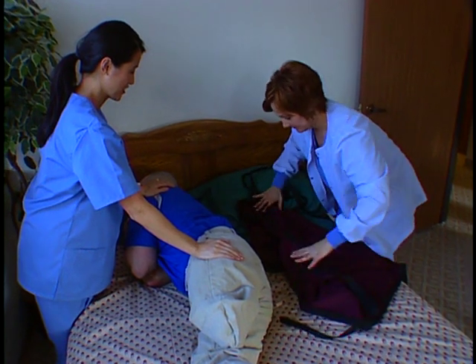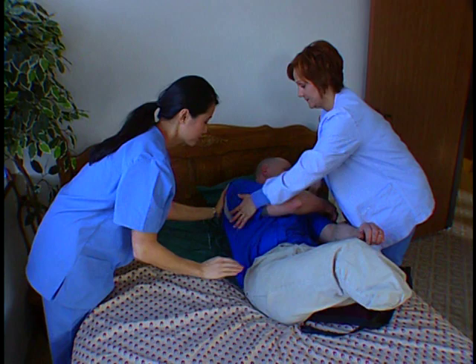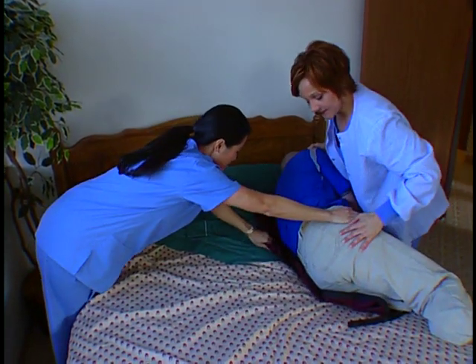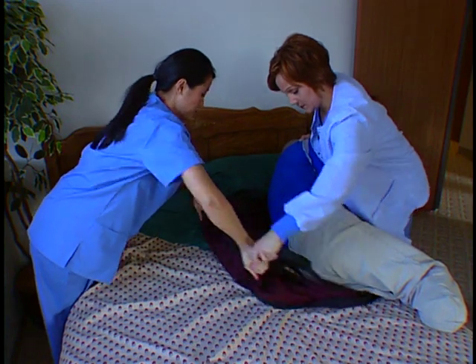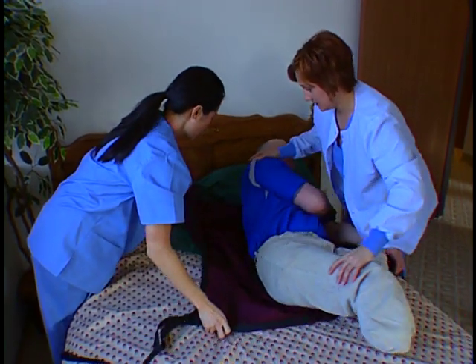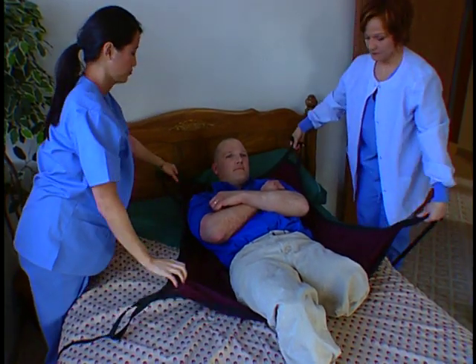designed to help the person who may have an amputation or a person who can't tolerate inner pressure on his or her thighs. It is beneficial in situations where the patient is unable or unwilling to assist the caregiver with the placement of the sling, and is more comfortable for patients with extremely rigid legs.